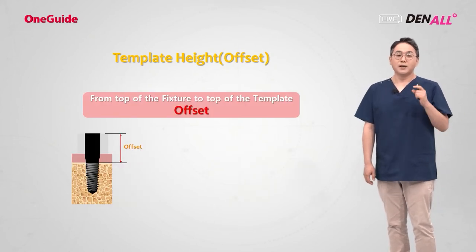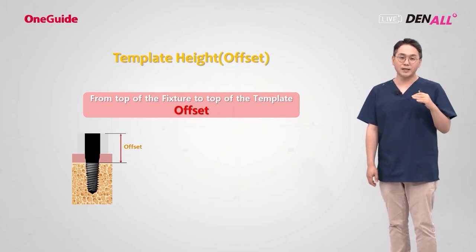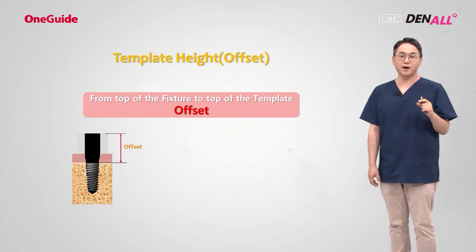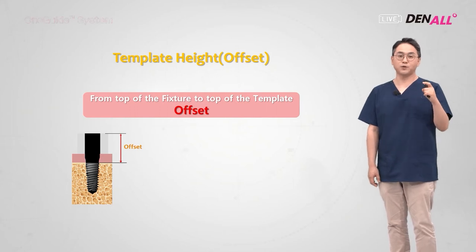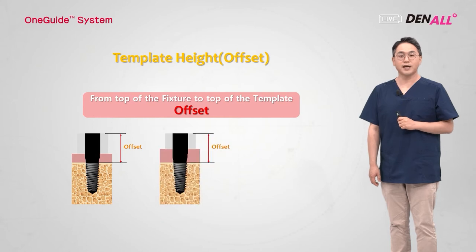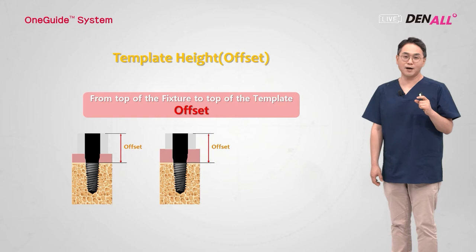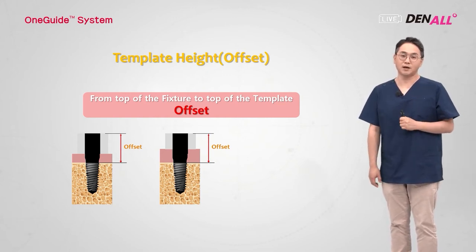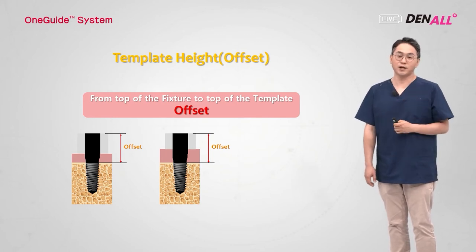Let's have a look at it again. If gingiva is that high and an implant is to be placed equicrestal, that is to the level of the crest, and the thickness of gingiva is 2 millimeters, the thickness of the guide hole is 8.5 millimeters, because from the top of an implant to the top of a guide hole should be 10.5 millimeters. What if gingiva is thick? Then the guide hole height should be lower. Let's assume that the gingiva height is 4 millimeters. The guide hole thickness should be 6.5, so 10.5 millimeters in total.